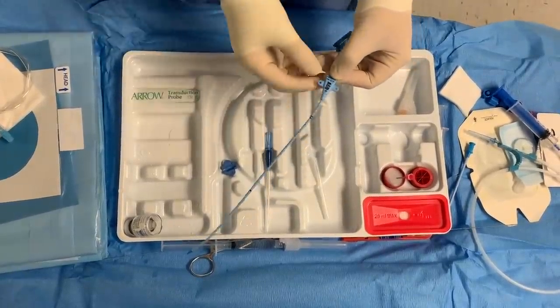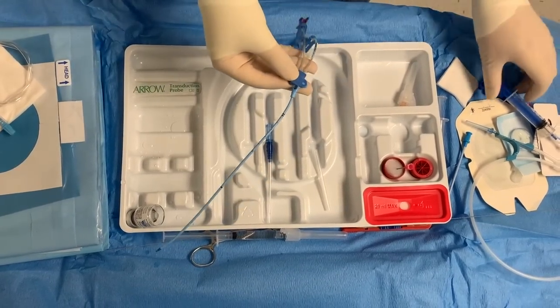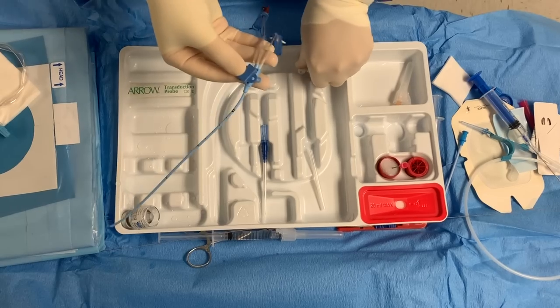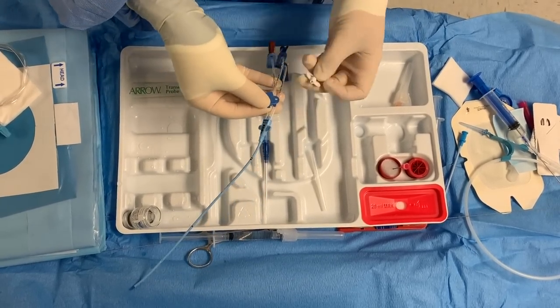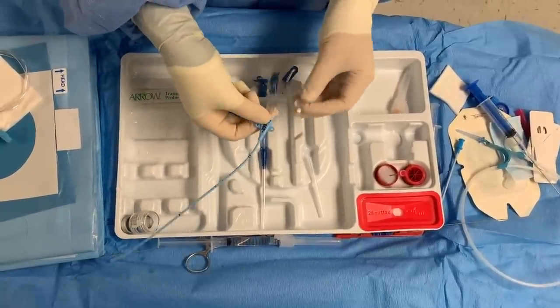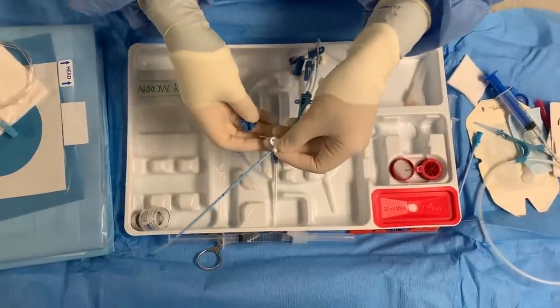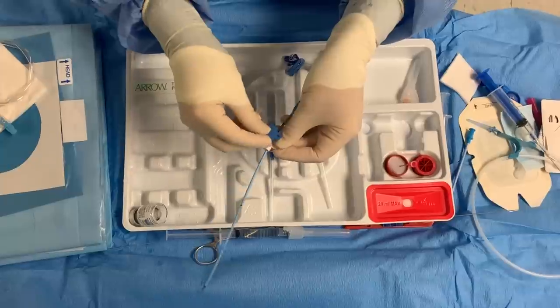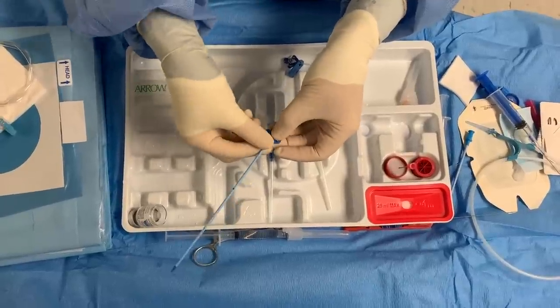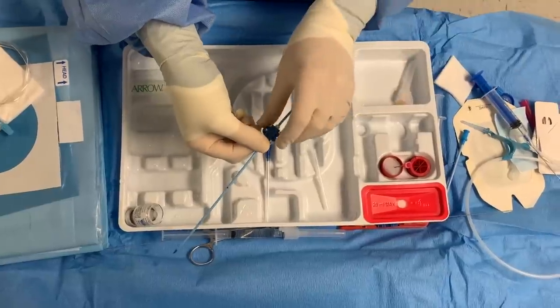So at the 15th mark is where you want to stop. You have this kit with the little blue and the little white one. The 15th mark is where the skin is going to be. You're going to put this on just like this, and then we're going to suture it and show how we suture it.